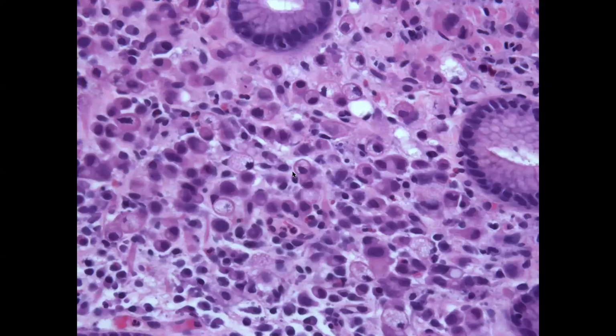And so you look on higher power, you realize, oh my goodness, these are actually not plasma cells here. They're still pretty small cells, but they're larger than plasma cells. And if you want a built-in yardstick, there are a few plasma cells in the background here, kind of in the lower left. And so that's what a normal plasma cell would look like. So even though these cells are still pretty small, they're a lot bigger than a plasma cell. And so this tells us this is actually a different type of cell.